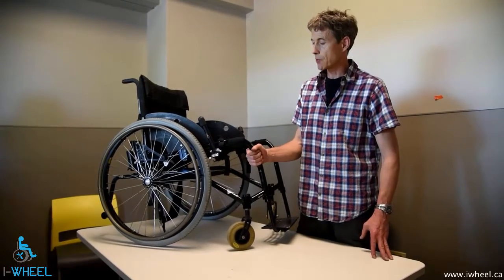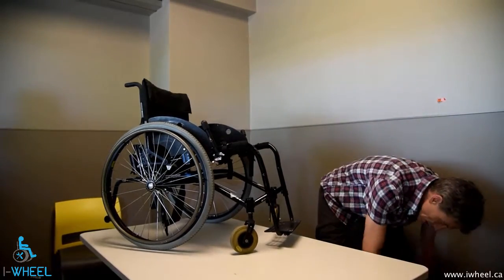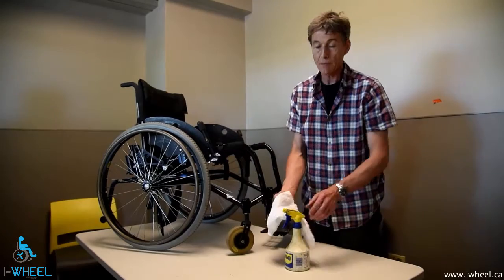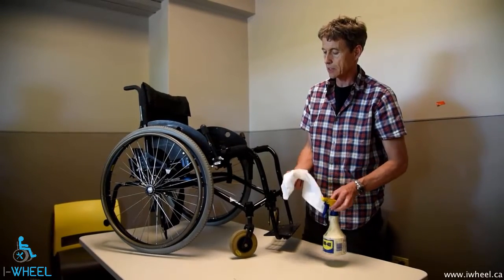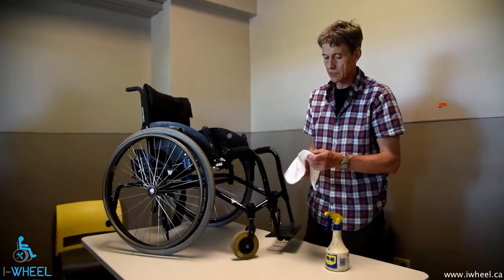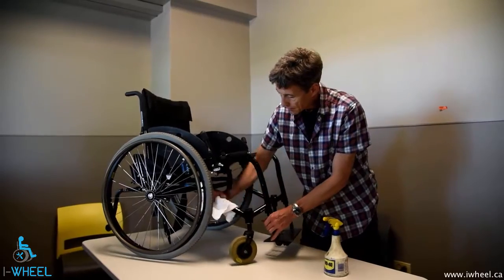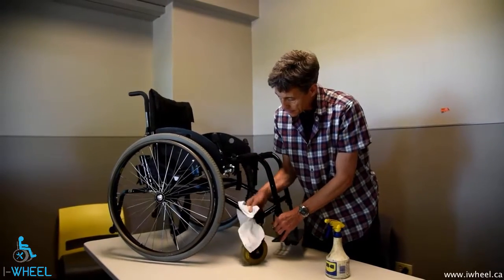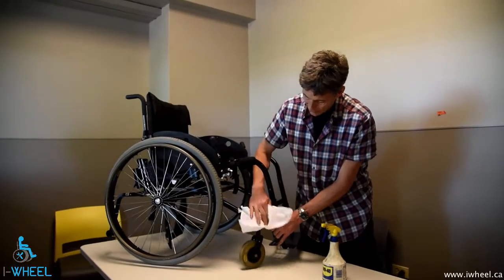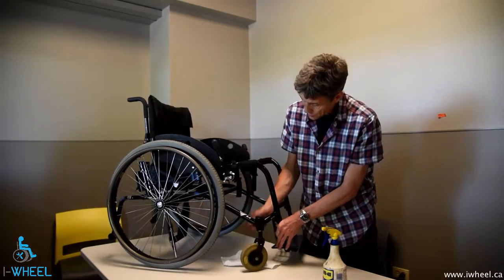For the frame, you can use mild soap and water as well. You can also use a rag and WD-40 — which, as I've said before, is not a lubricant. It's a cleaner, it's a solvent, it's anything but a lubricant. Just spraying a little on a cloth and wiping down tends to leave it with a little bit of a protective layer and it does emulsify any food that you have on the chair.